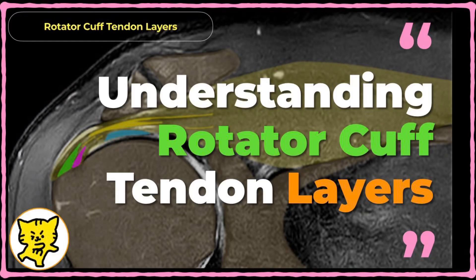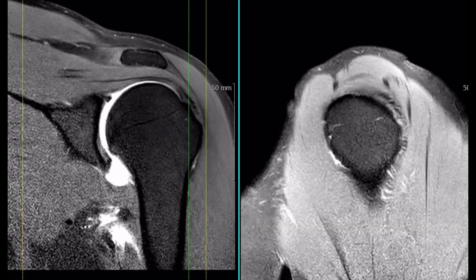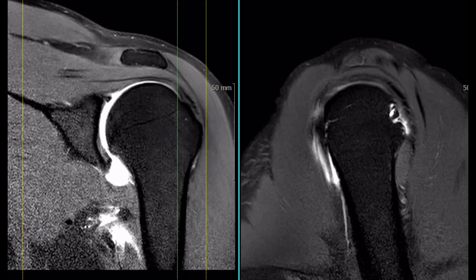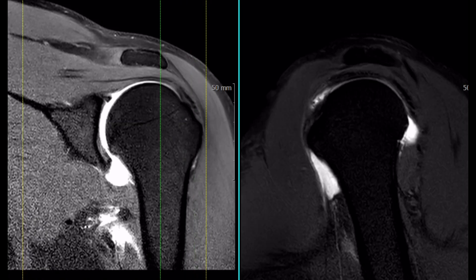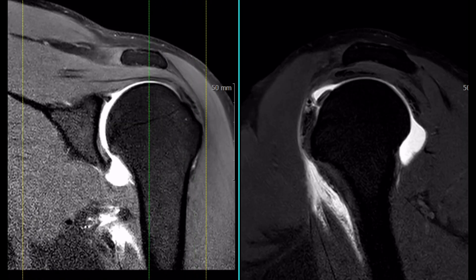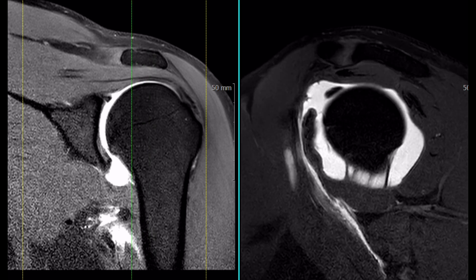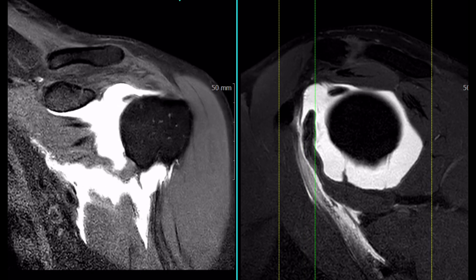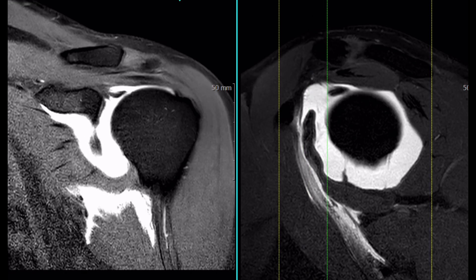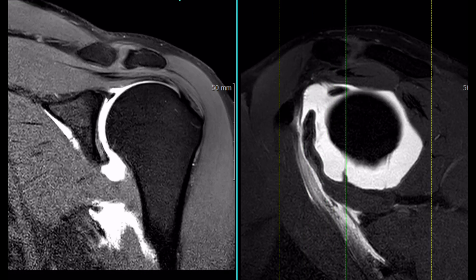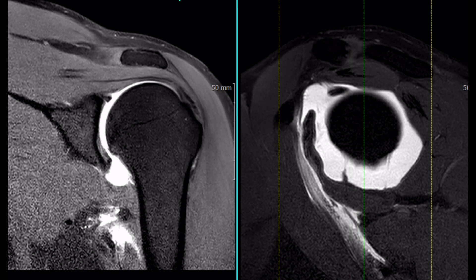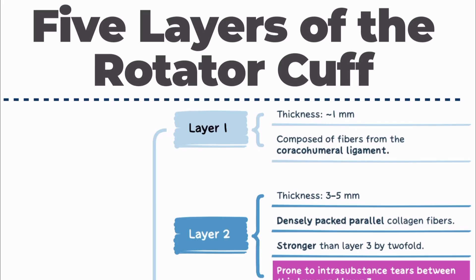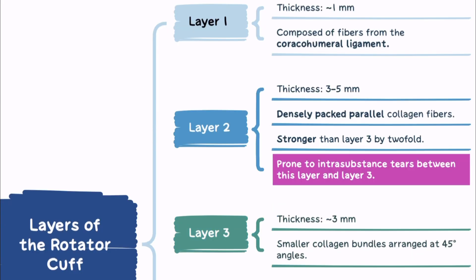The supraspinatus and infraspinatus tendons consist of five histological layers, though not all of these layers are clearly visible on MRI. These layers are best evaluated using oblique coronal and sagittal MRI, and understanding their anatomy is critical for accurate interpretation.